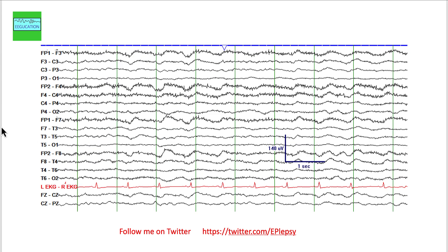Looking at another sample, the first question to ask is: what is the state of the patient — awake or asleep? The green lines are separated by one second; odd numbers record from the left, even from the right. We see relatively low amplitude delta activity with superimposed fast activity — partly beta, partly muscle artifact. To differentiate physiological from pathological slowing, stimulate the patient: if they were asleep, they should revert to faster frequencies, but a comatose patient will not necessarily return to a posterior dominant alpha rhythm.